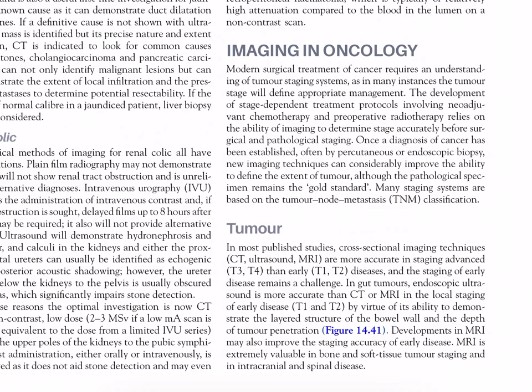The development of stage-dependent treatment protocols involving neoadjuvant chemotherapy and preoperative radiotherapy relies on the ability of imaging to determine stage accurately before surgical and pathological staging. Once diagnosis of cancer has been established, often by percutaneous or endoscopic biopsy, new imaging techniques can considerably improve the ability to define the extent of tumor.